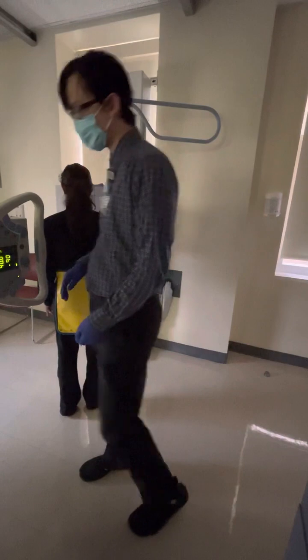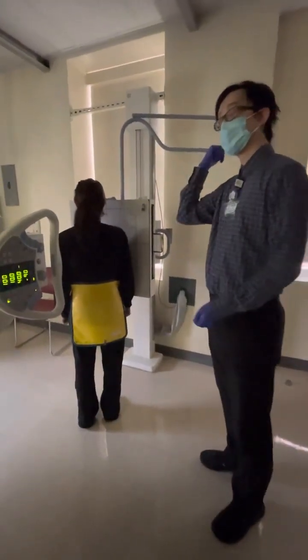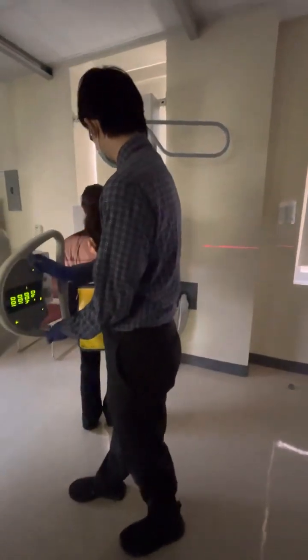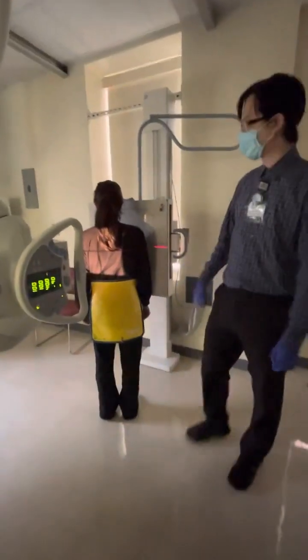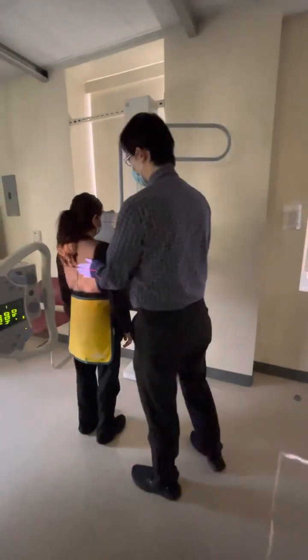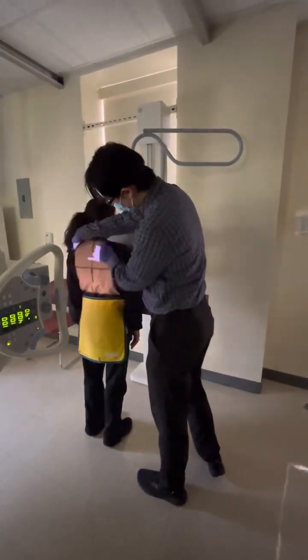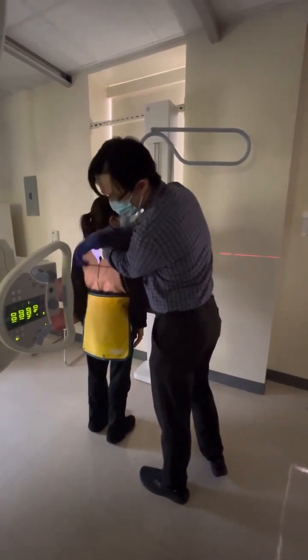So as far as positioning, let's go ahead and start with our upper ribs. Easiest way to do this, right? When you start off, just start the patient off PA. So you just get them nice and flat against the IR, and find your centering just like normal. Right? So you're going to find your T7. Go down your 7 inches.